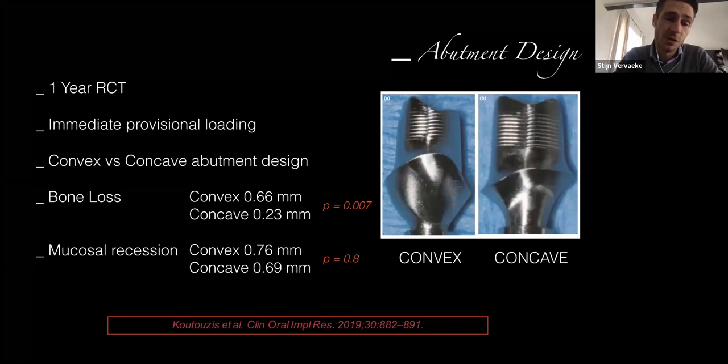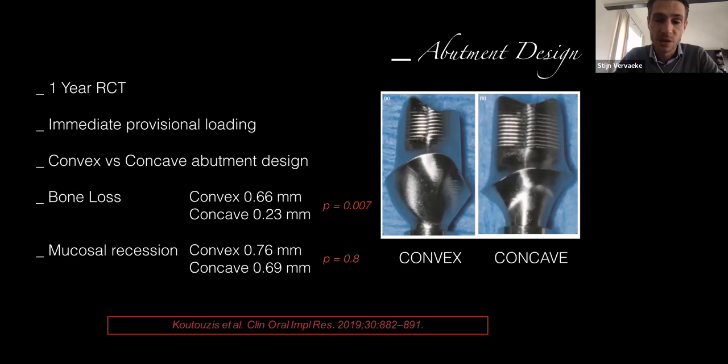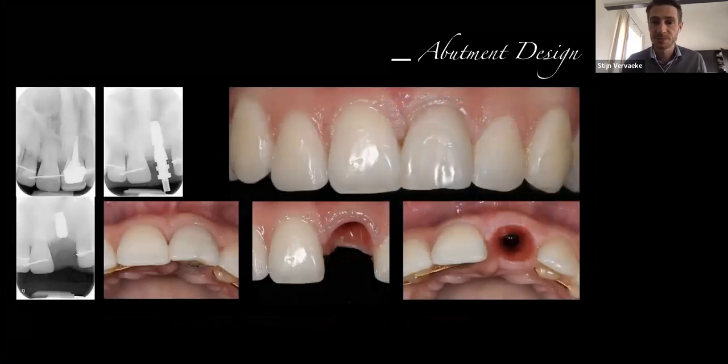This is something, if you look at the Atlantis abutments you've been working with, you won't find convex abutment designs. So they are also always very nice concave. They start from the implant shoulder, and then they go up smoothly, and then they go wider, but they are not going wide directly from the implant shoulder towards the bone, which is very important.